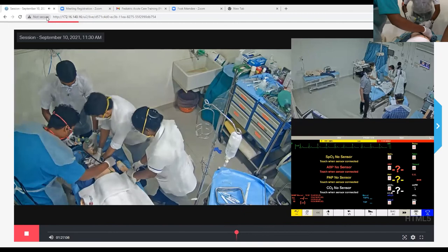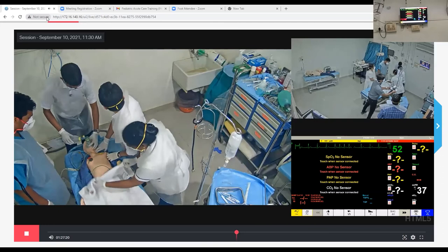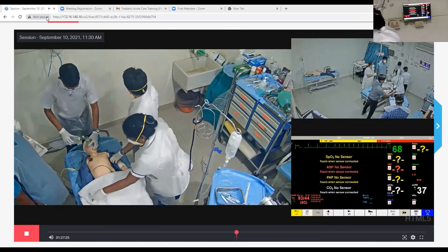Okay, can we see the rhythm again? Heart rate is very good. Thank you. The rhythm has returned. Pulse, what about the pulse? Yeah, I can feel the pulse now. Very good. So we have reverted the rhythm into sinus rhythm. Thank you, team, for your resuscitative efforts. Thank you, everyone.